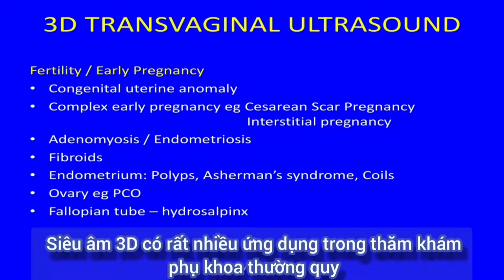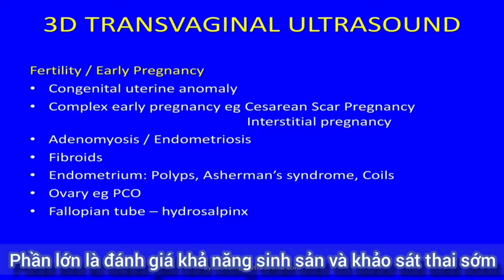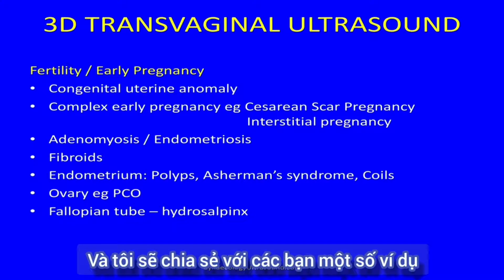3D transvaginal ultrasound has many routine applications in gynecology, many of them in fertility and early pregnancy, and I'd like to show you some examples.